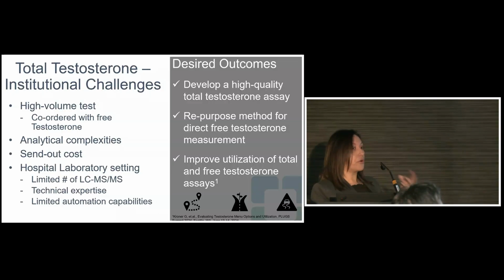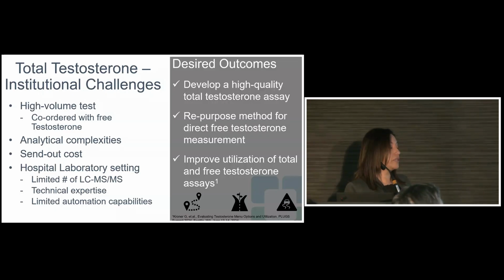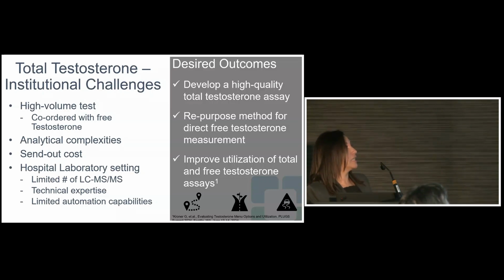So when we approach developing total testosterone and the analytical complexities, we had in mind that we had to also offer free testosterone testing. It was our sixth highest send-out cost testing, and we are a hospital laboratory setting with a limited number of tandem mass spec with limited automation and technical expertise.